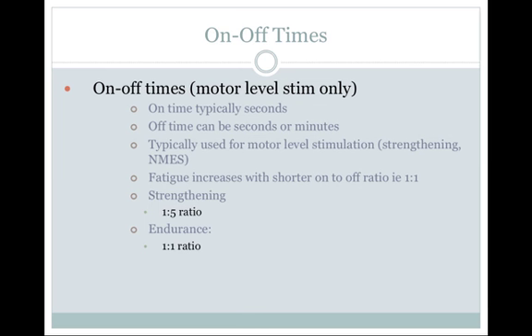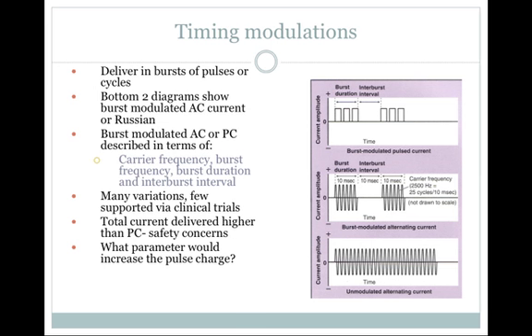And if we want to do strengthening, just like going to the gym, you do a set, say a set of bench press, and then you take a minute or two in between and then do another set. That's really what you're looking at here. So for strengthening, if I was stimulating for 10 seconds, then I'd rest for 50 seconds before the next stimulation would come along. So looking for those two different effects, we'll see those different things in the charts.